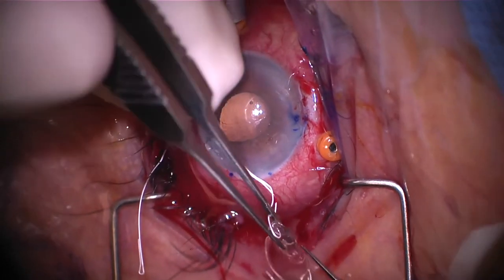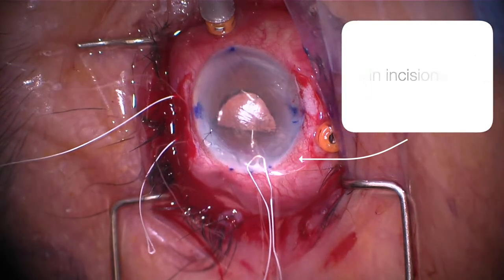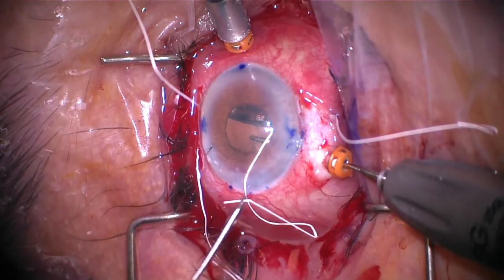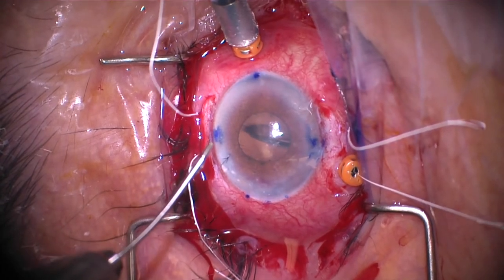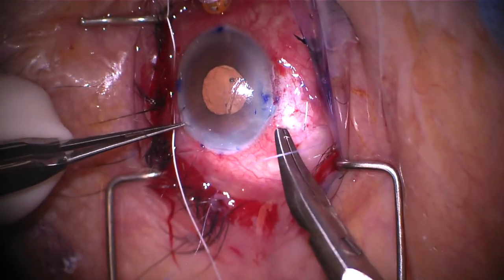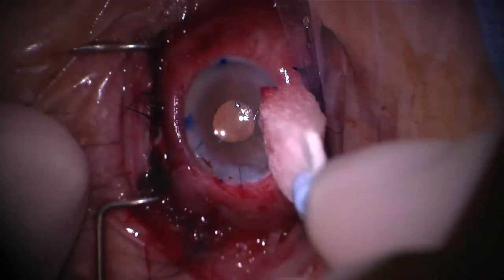We've got the leading haptic pre-laced. The distal haptic is laced through the little A-frame pillar, but the sutures haven't been pulled through the sclerotomies yet — that ensures proper suture orientation once the implant is in the eye. We drop the IOL into the posterior segment; here I grasp the distal suture first, then the proximal. The implant looks a bit off initially, but once the suture is secured it will right itself and flip to correct orientation. We remove the trocars, balance suture tension just like the AO60, bury the knots, close the sclerotomies, and close the conjunctiva. Through a smaller incision than the AO60, we've got a hydrophobic implant sutured in place with good centration and minimal tilt.